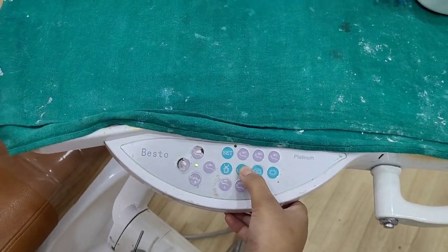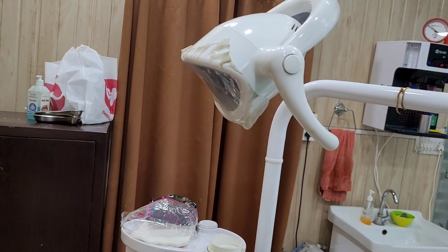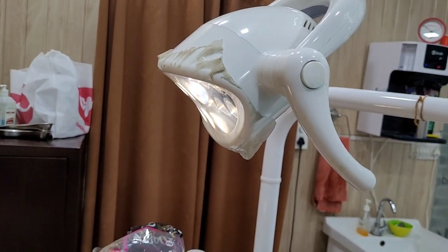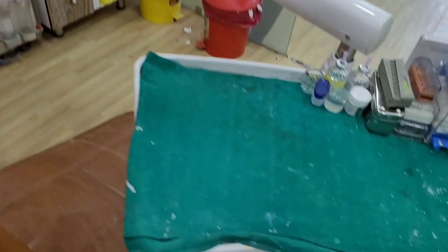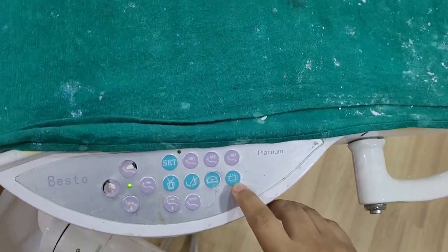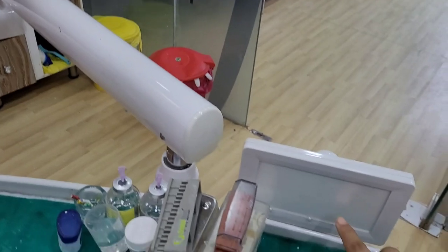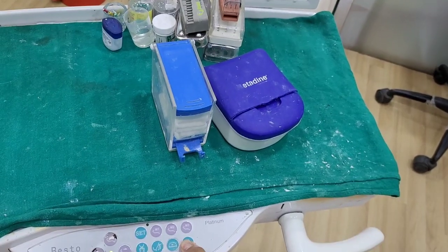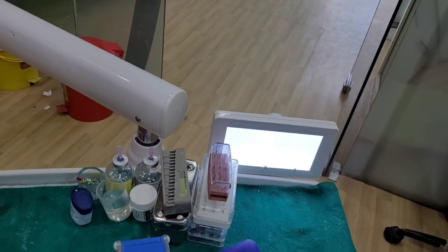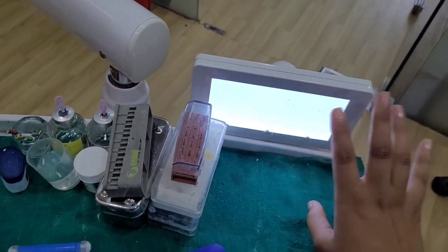The next button is for the light. If we press here, the light will turn on and off. You can also use the light as a sensor. The fourth button is for the film — for example, for RVG. When we press here, the light will turn on and we can use the holder here to easily take the film.